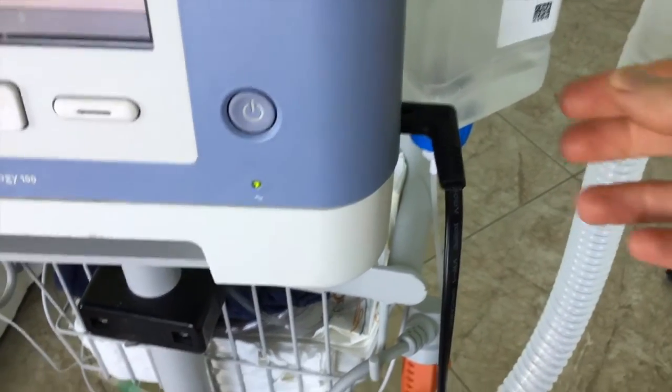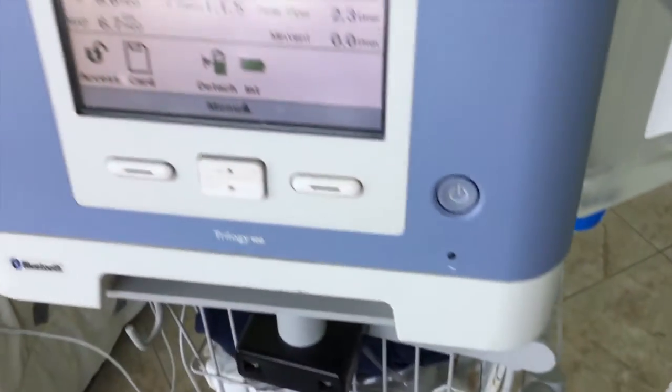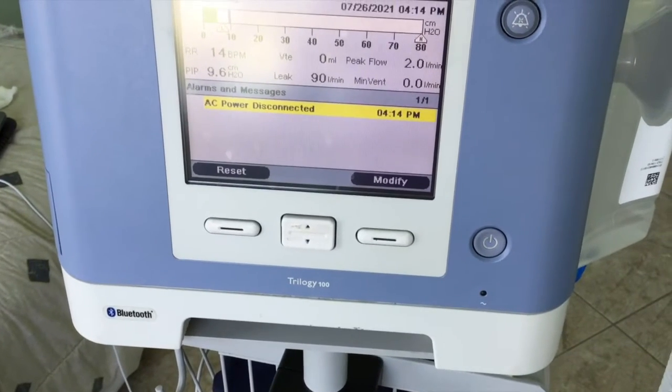Once my saline has run through my nebulizer, I am now ready to get out of bed. To leave my bed, I need to unplug my ventilator and heater humidifier. Since my ventilator is able to run on battery, I leave the ventilator cord plugged into the electrical outlet and disconnect the power cord from the ventilator. When I'm roaming around the house, I usually do not bother to plug in my ventilator because the batteries last about 8 hours.